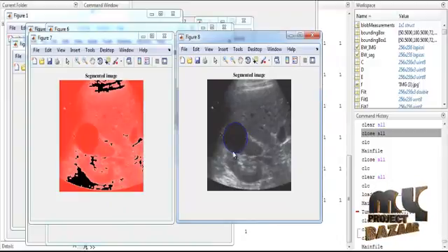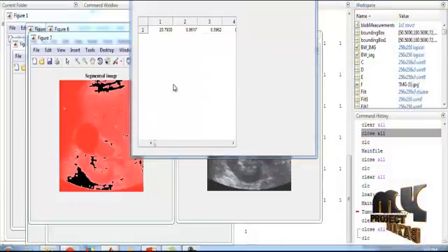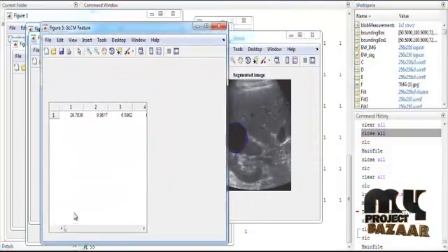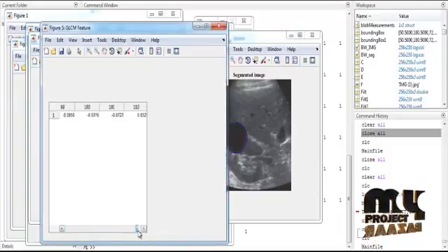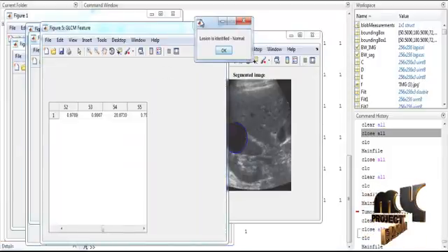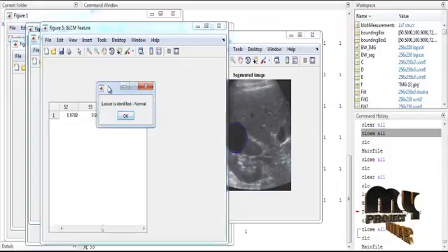Now, the region of interest, that is the affected part, is only shown in the elliptical format and the other background is eliminated. After that, the features are extracted from the image by using the GLCM feature extraction method. Hence, the values of the features are shown in the table. Now, the final classification result is shown in the message box. Hence, the identification type is normal lesions.